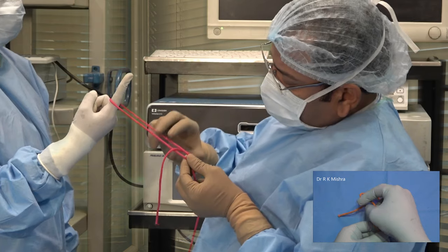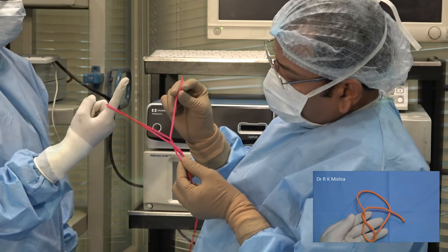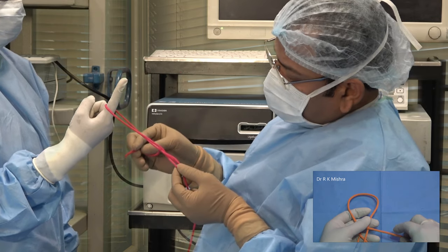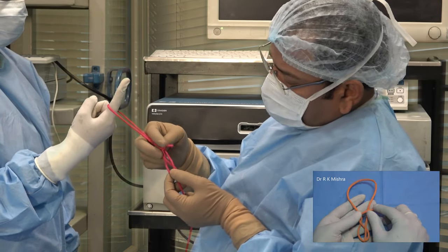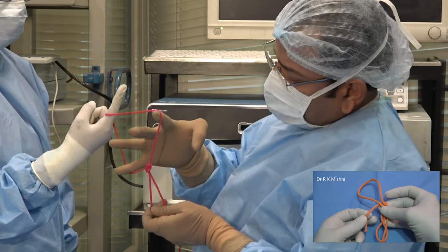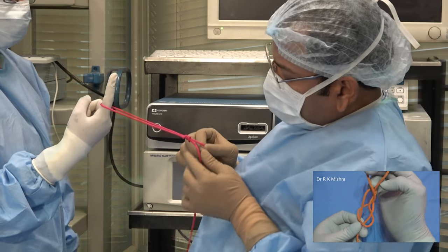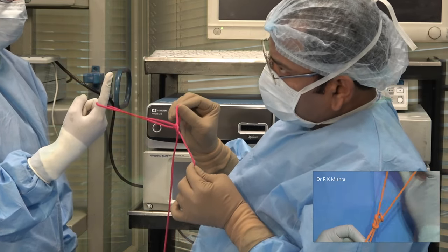After that, you will encircle the left limb and come from below upward, and then you will encircle both the right and left limbs, and then you will go to the first hitch. This is done — you can slide it wherever you want.